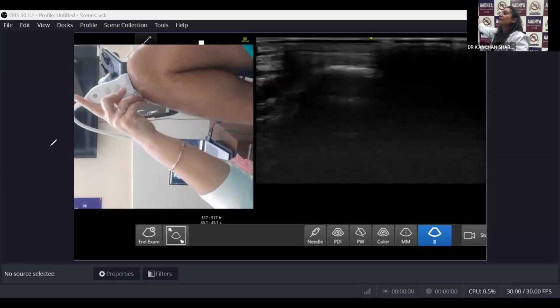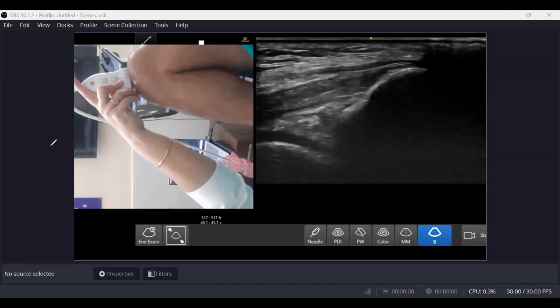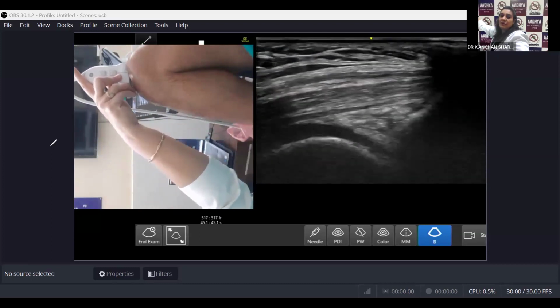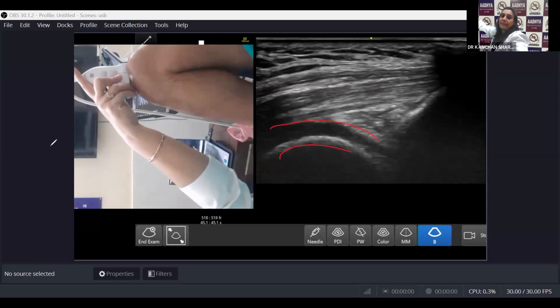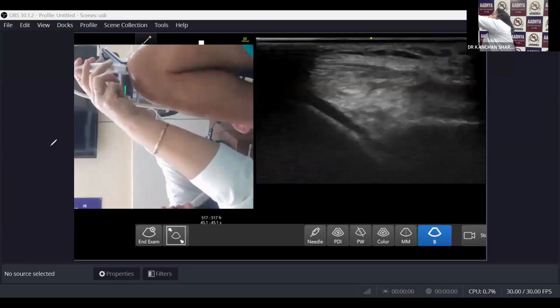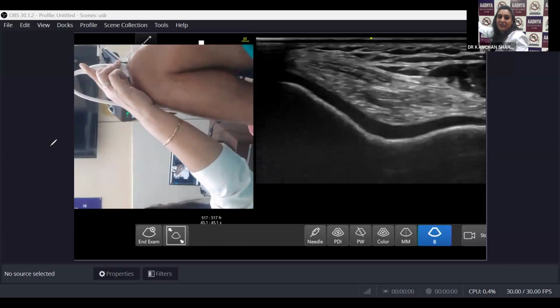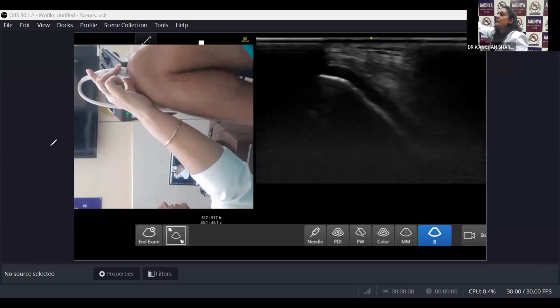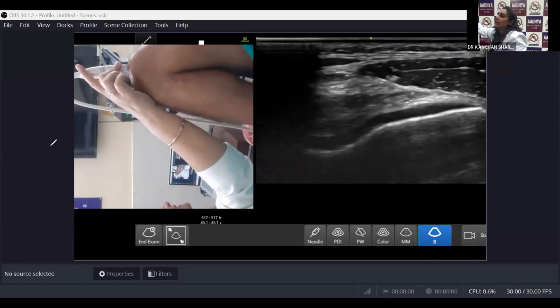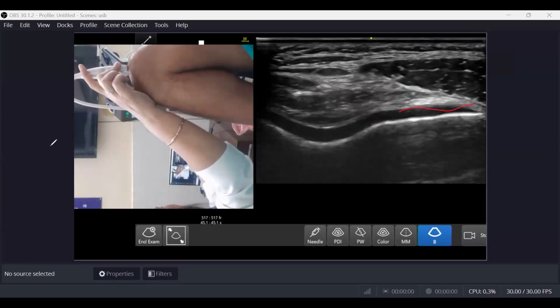Okay. So your patella is dipping, right? This is your patella, that is your quadriceps tendon. Fine. You can very well see the trochlear cartilage here also. This is your femur condyle. At this position, you just rotate your probe and you will be able to see. Supposedly you miss it, that is another way of finding it. Then evaluate this cartilage fully like this. See how beautiful his cartilage is because he's young. This whole is the cartilage.